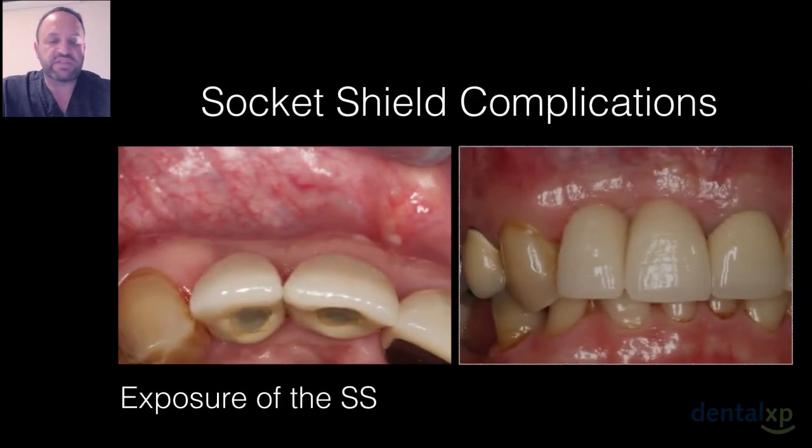And you can see here, this is a case that's probably about 2 years old now. You can see the beautiful soft tissue healing, everything happy. Although we've lost some vertical height because we lost about 1 millimeter to 2 millimeters of that soft tissue, but had we not had that complication, you can see the buccopalatal maintenance, and we probably would have had a much better aesthetic result from a gingival recession point of view. But again, we were very lucky, right choice of case to start working with, low aesthetic value, low lip line, and no real problem in the long run.